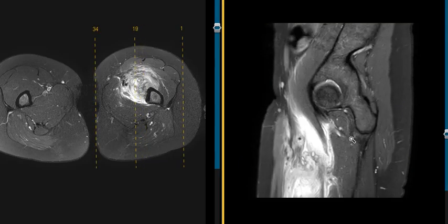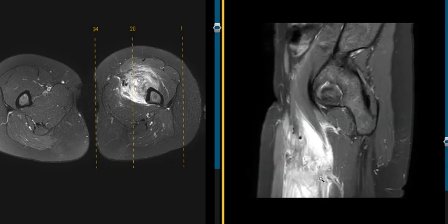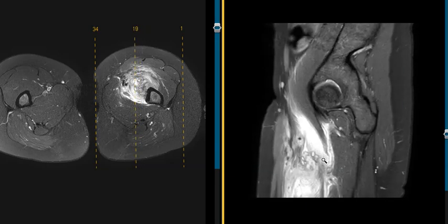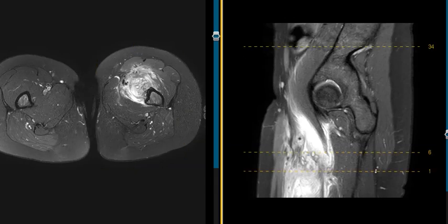We have one more thing that is really helpful. This is a sagittal view that shows this complex process — it looks just like malignancy. You've got to be careful not to biopsy because it'll show malignancy.